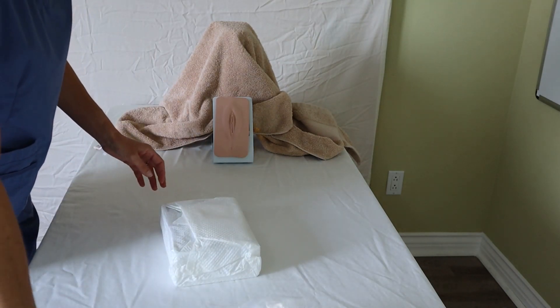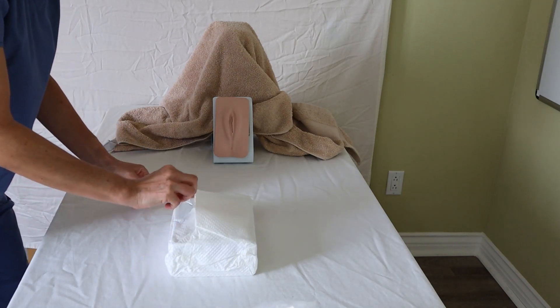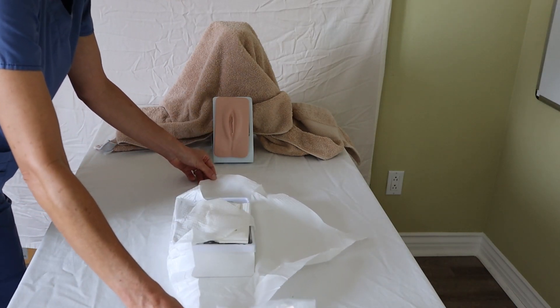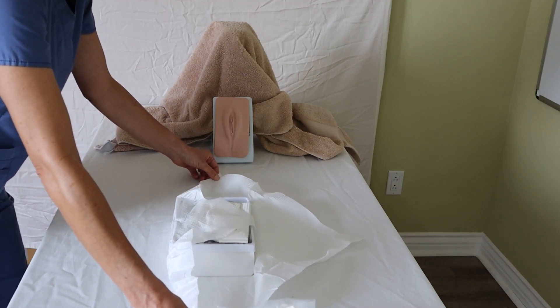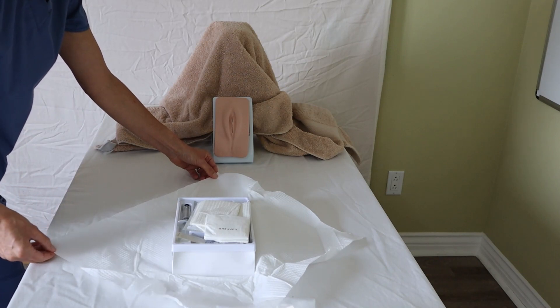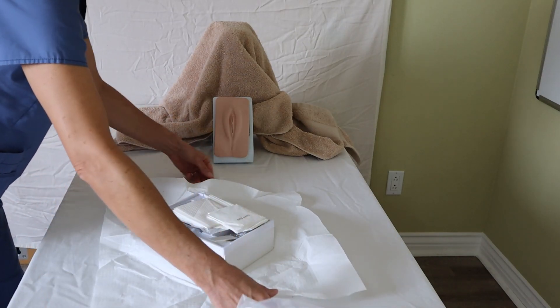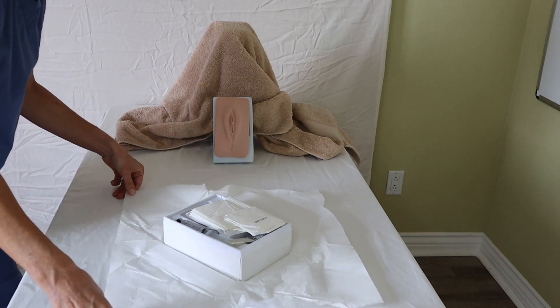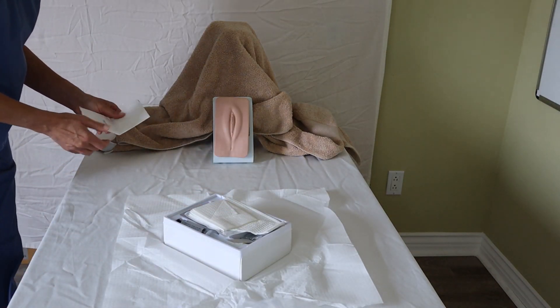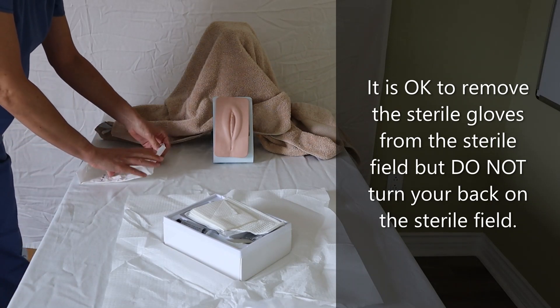To open my sterile kit, I will use the tab and pull it away from me first, then open up the sides. Remember that only one inch of your sterile drape is considered non-sterile, so make sure you don't touch inside the one-inch margin. I can see my sterile gloves right here. What I like to do is turn this kit so I'm lined up more straight. I take my sterile gloves and don them.